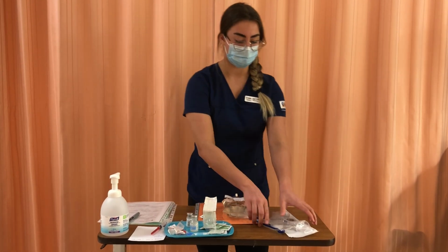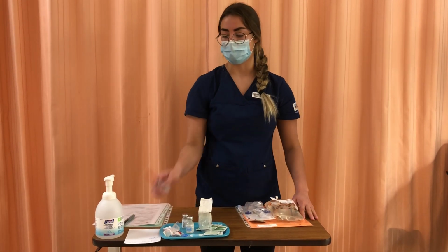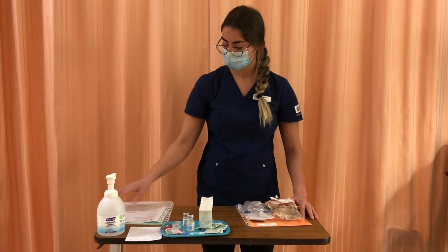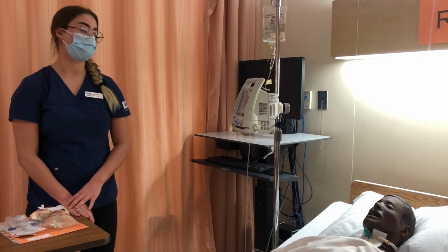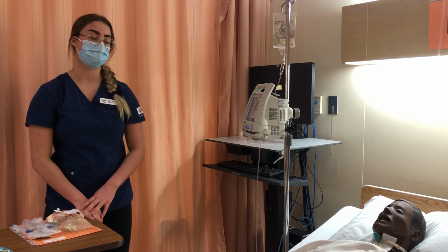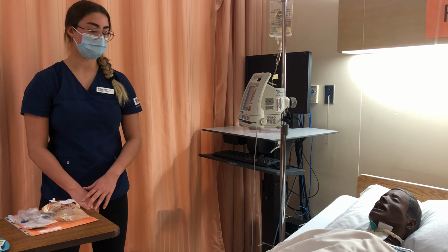So I'll gather all my supplies, and then I'll make sure that I put this in the sharps container. Okay, so I'm ready to go in the patient's room, so I'll knock on the door and do my entrance safety check. The patient doesn't appear to be in any distress. The bed's in lowest position, the call bell's within reach, and they have an IV line running.